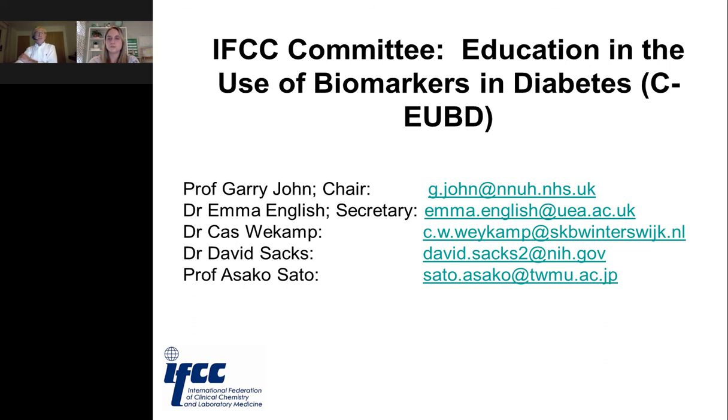The choice of detection method is less important than the quality of the result it is giving you. So you need to actually decide as a laboratory director or as a scientist within that section as to what is important to your laboratory and what's the method that gives the best results in your particular laboratory.